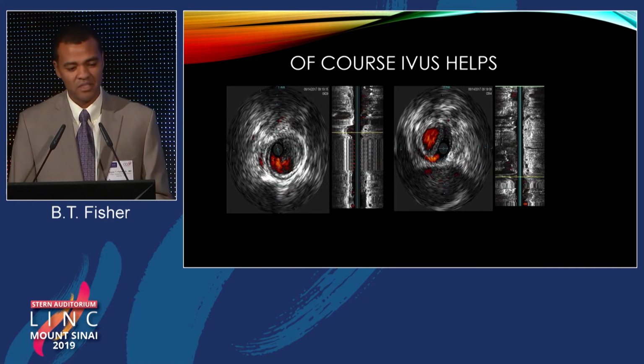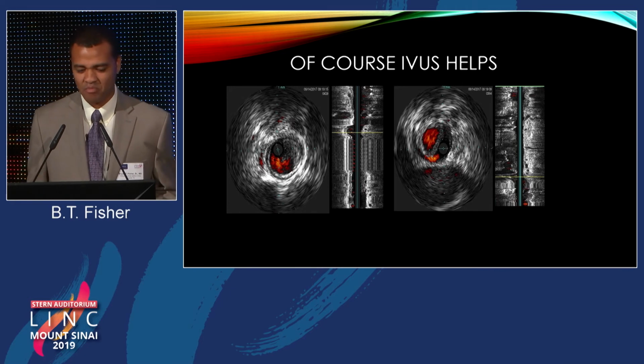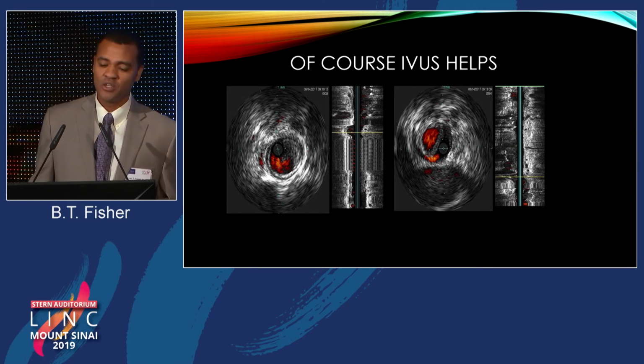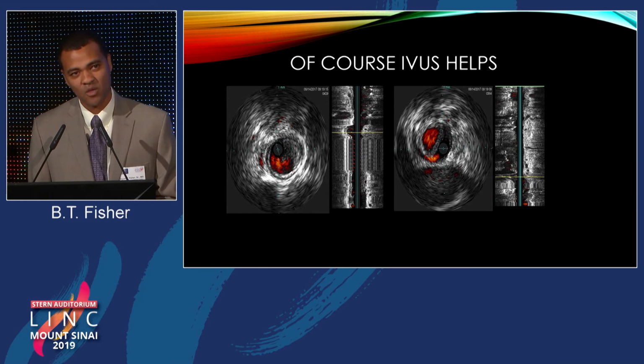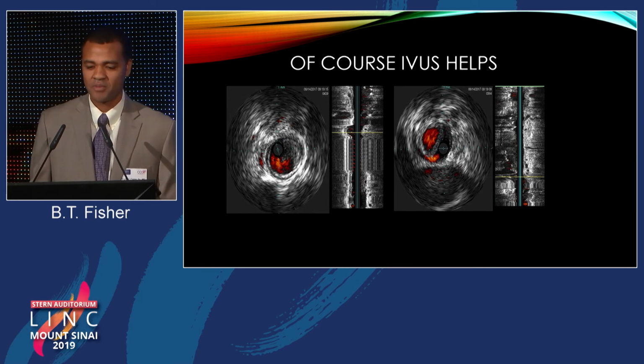I like to use IVUS. I know a lot of people talk about it taking more time. Use IVUS from retrograde with single wire access or single wire control. When you floss the patient, I like to take the IVUS catheter back and forth to see exactly where I'm in the vessel and again help guide my therapy.